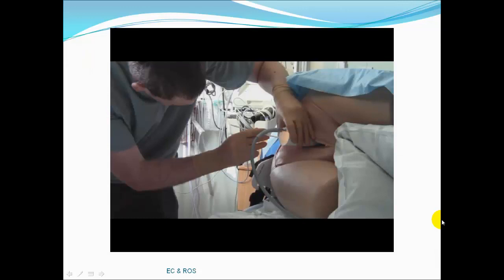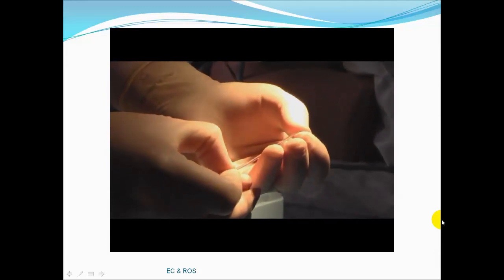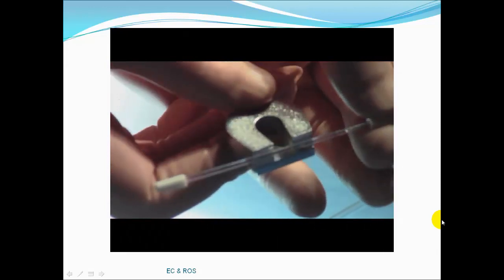Processing the sample. Ensure bleeding from the scalp is stopped and apply pressure if necessary. Seal the tube with caps. Mix the tube for 50 seconds, if necessary, with a mixing wire and magnet. This reduces air bubbles and prevents coagulation of the sample.